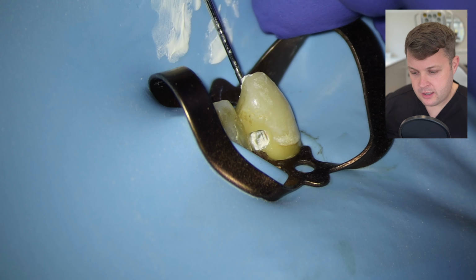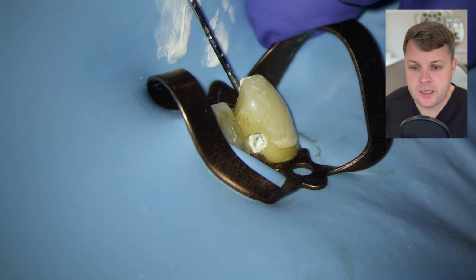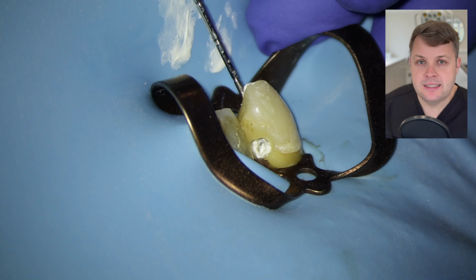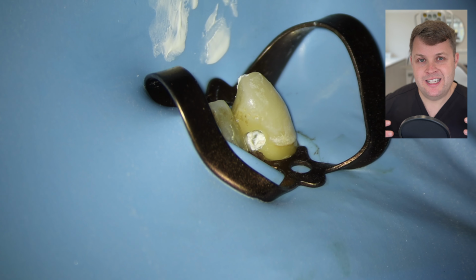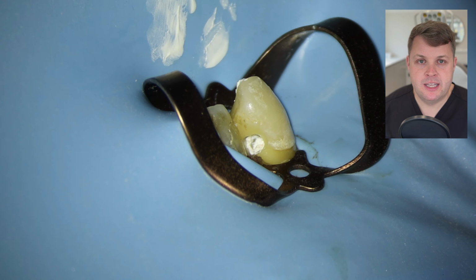I know that the canal space is quite wide, so I really want to condense down our GP with these Max 2 pluggers. Really push it down. And what you want to make sure is every single part of the canal space is being filled, and you've got this kind of 3D fill. And once we've condensed everything down, we're going to do our filling.